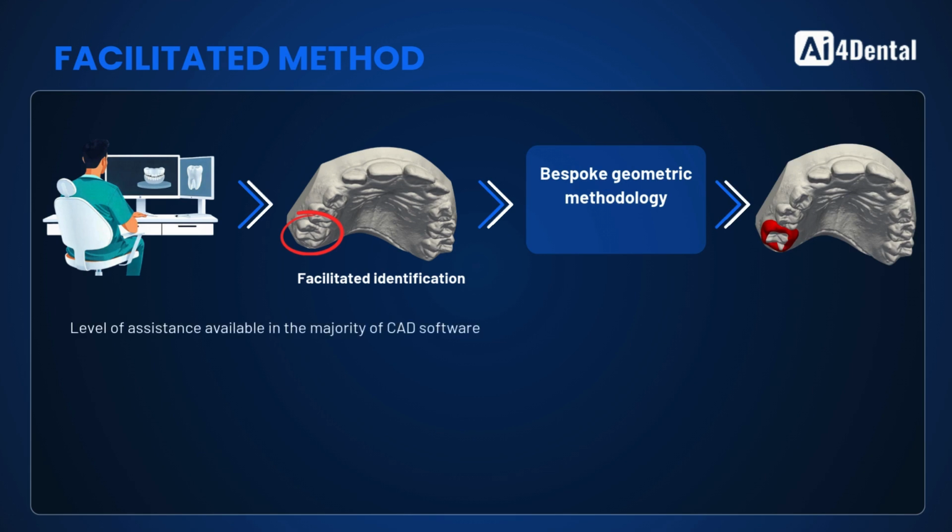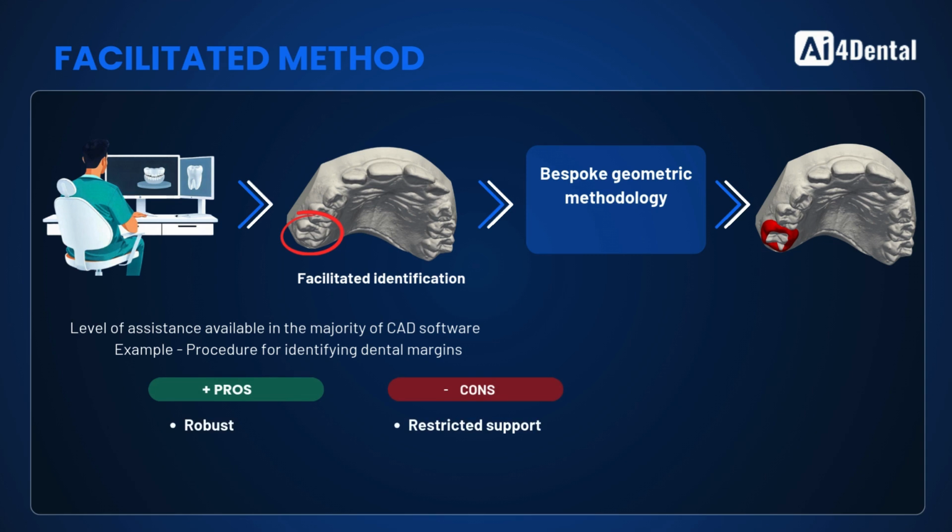In practice, these assisted detection algorithms require user clicks, followed by geometric approaches to detect contours. These algorithms are fully integrated into today's CAD software to navigate the model and design orthodontic elements. While effective and robust, this process is time-consuming and repetitive for the user. Moreover, it is inherently limited because it relies on a serial workflow. Each case must be completed before moving to the next, as manual intervention is required for every instance.